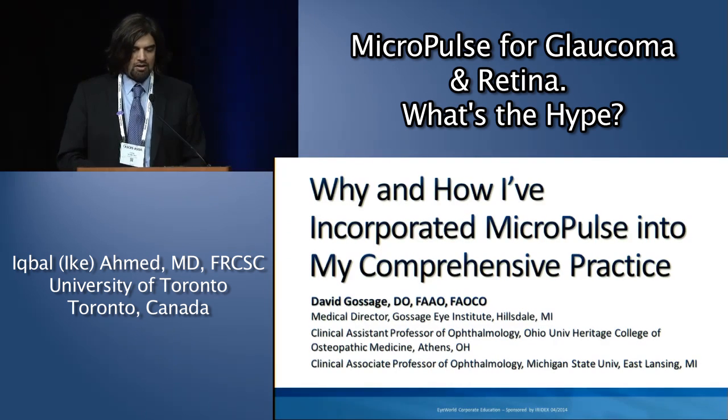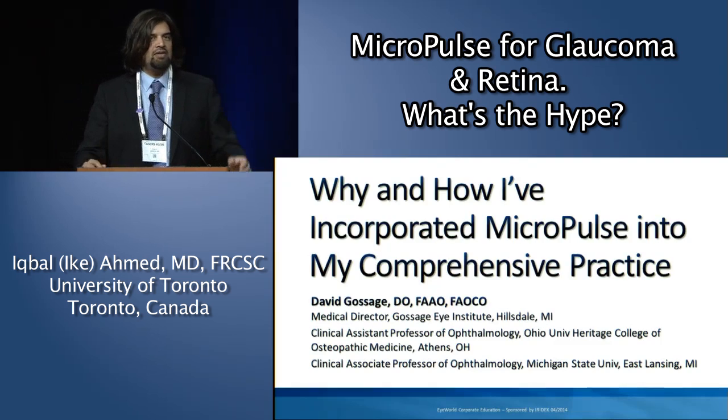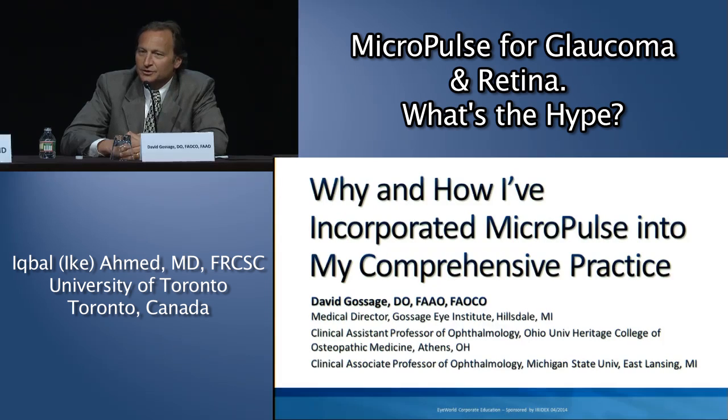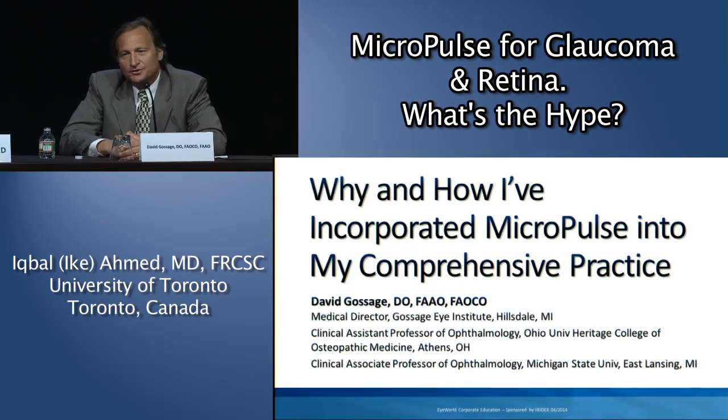One of the questions that has come up as well is, in terms of primary therapy, is this something that you bring up during discussion with patients at diagnosis of glaucoma? Do you suggest it? Do you not bring it up? How do you handle patients for primary therapy? I will use it as a primary therapy for glaucoma. I actually leave it up to the patient to make the decision. I'll explain to them the difference between using medications and or laser.